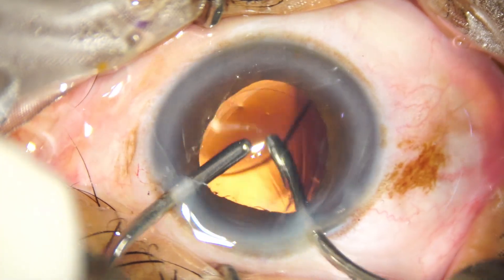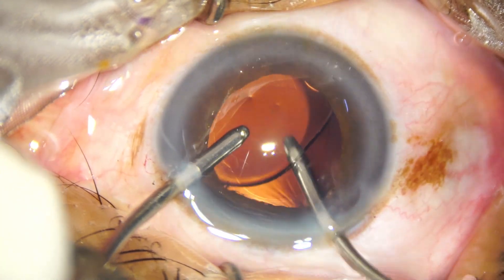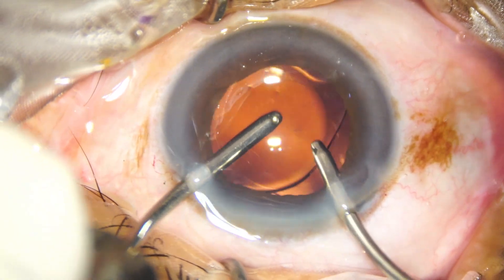Now, the irrigating cannula goes behind the lens and keeps irrigating, while aspiration is above — that is, in front of — the lens.